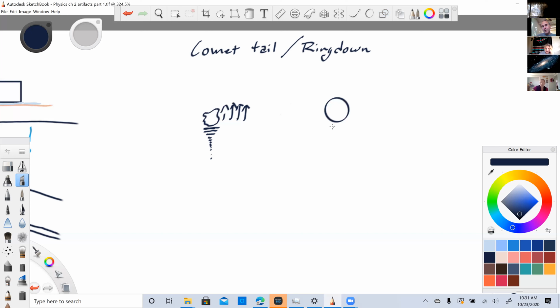And so what we end up seeing is these reverberation lines, and by the way, they're very close. They're so close together that what you end up seeing is just an echogenic streak, like a streak of light down the screen. And in the case of a true ring down artifact, it can go all the way to the end of the screen.